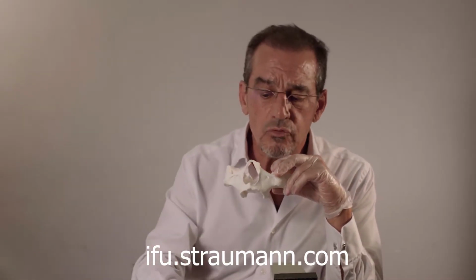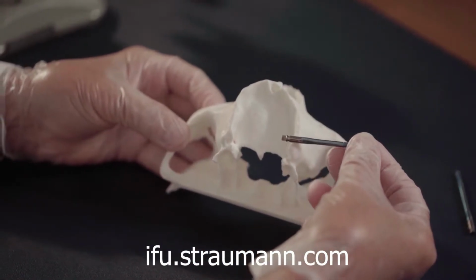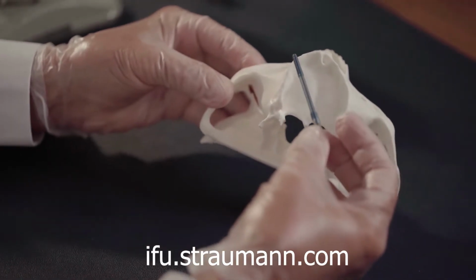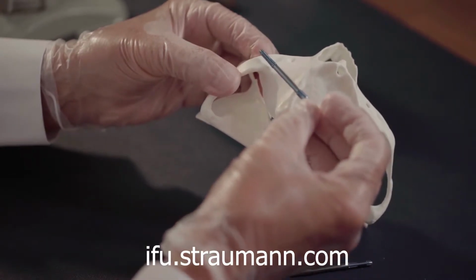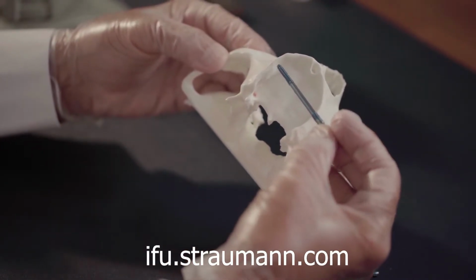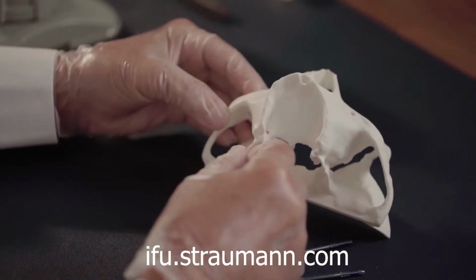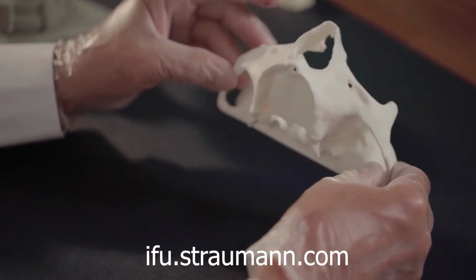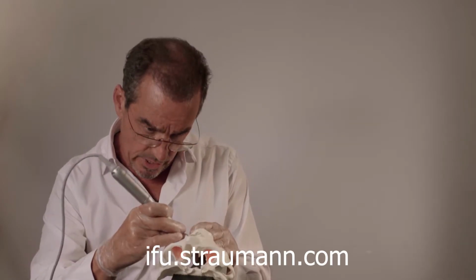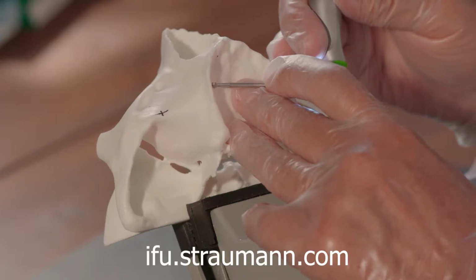This means that on the left side we are going to use the flat ZAGA design, whereas on the right side, since we are going to take advantage of this small remnant of bone, we will make a round perforation. Our osteotomy is going to be circular, so we are going to use the Straumann ZAGA round implant on the right side. We are going to start placing a round implant on the distal second premolar, and for this hands-on we are just placing two zygomatic implants.